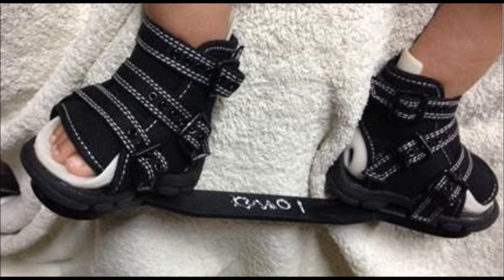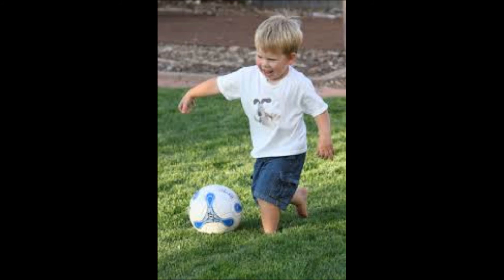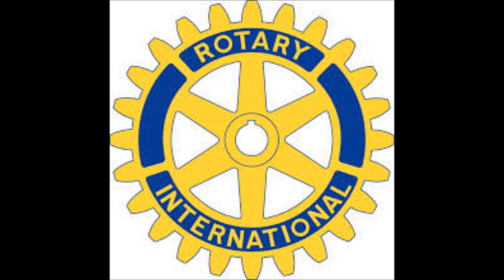The brace consists of a pair of special shoes attached to a removable bar, keeping the feet at a desired angle while the child sleeps. Soft, molded inserts help prevent skin irritations.